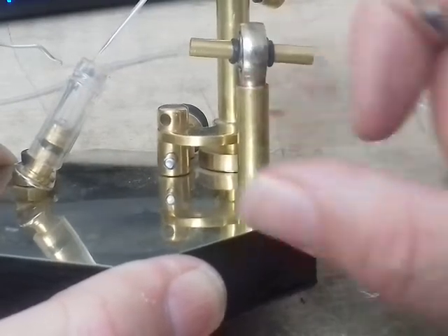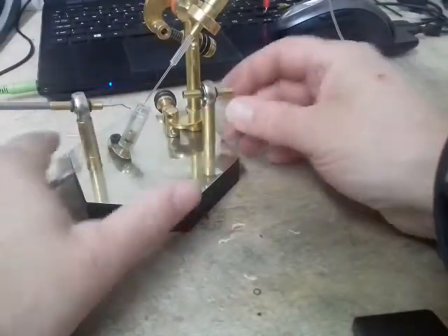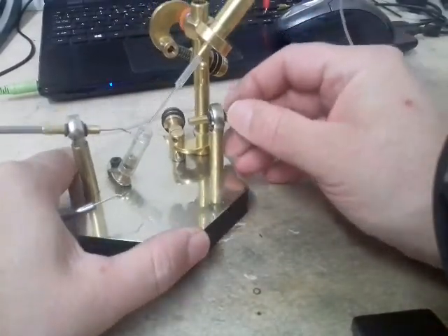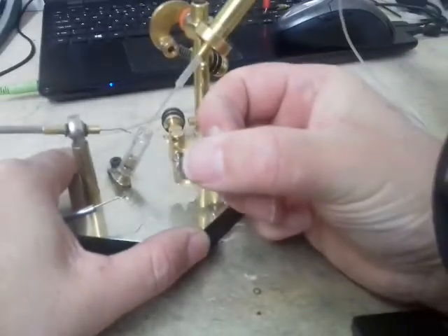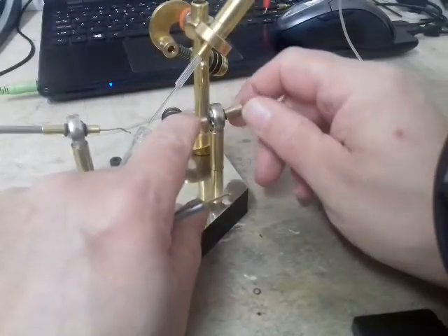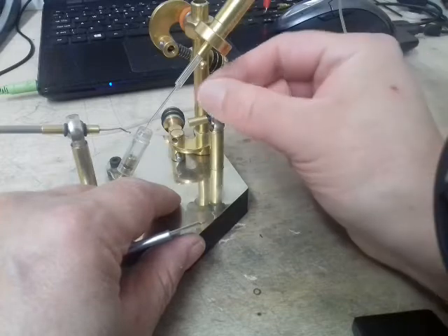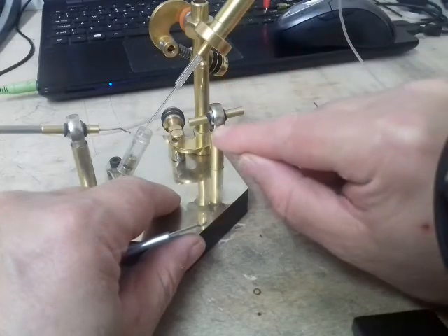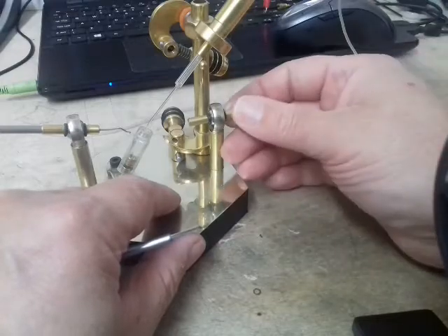But like you say, the ball needs to be turned. I can explain it a better way. Take all this mechanism out and turn the ball so it's upwards like that. Then you can drill down through the top without marring the nice surface on the ball. So that's another way of putting a nip screw on the top. Or you could do it at the side or at the front. It doesn't matter where you do it, because it's 360, whichever way you do it.